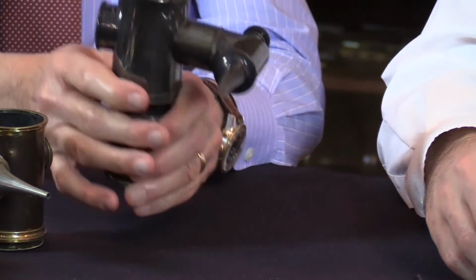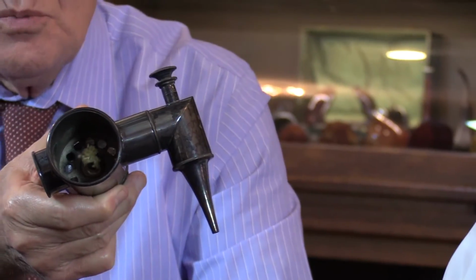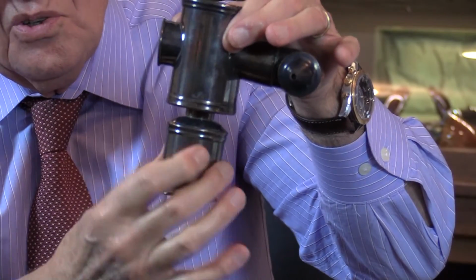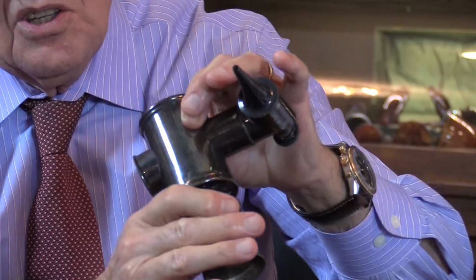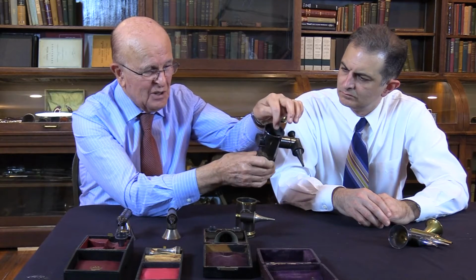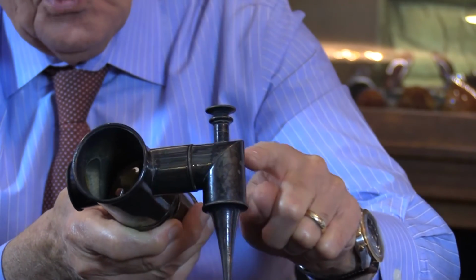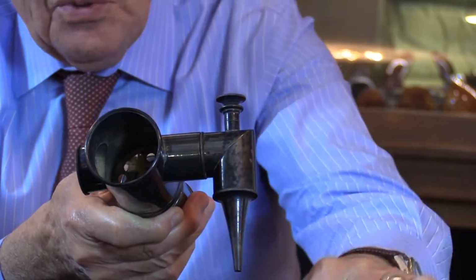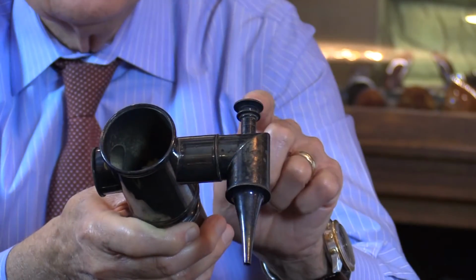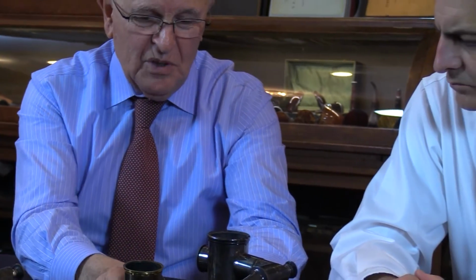And somebody here is using an alcohol sponge, and you can see the alcohol sponge in the bottom of this opening, and this is where the alcohol container is. The wick is right here, and again the same principle. The light comes from the alcohol lamp. It goes through this tunnel here. It hits the 45-degree mirror here, and reflects towards the eardrum. And this is the eyepiece with the magnifying glass. I believe that these two made a lot of difference in the pre-electric otoscopes.